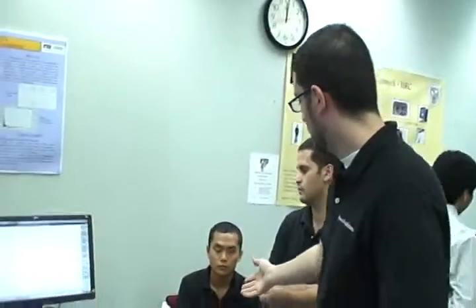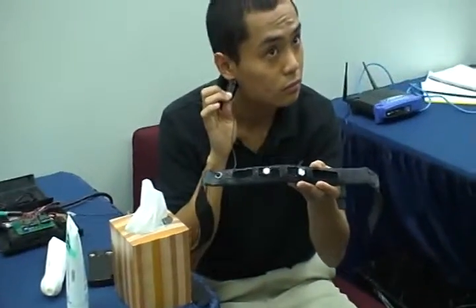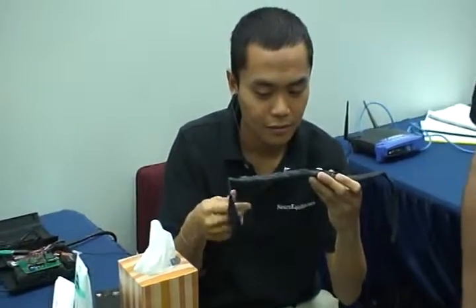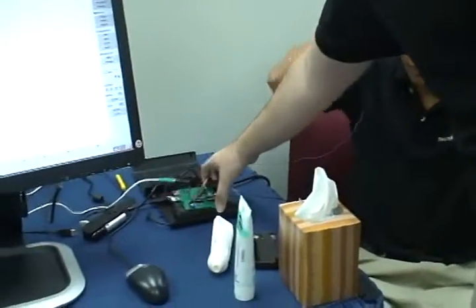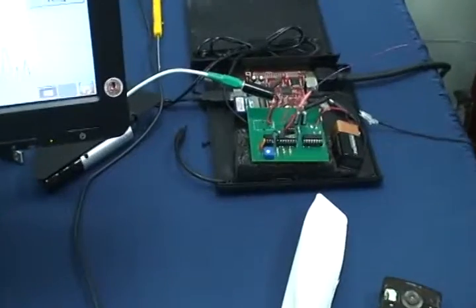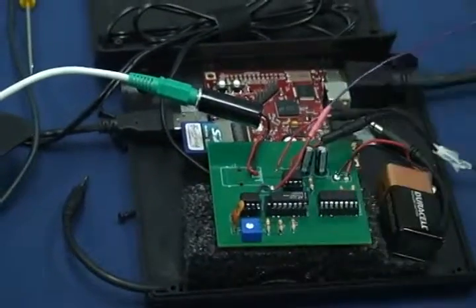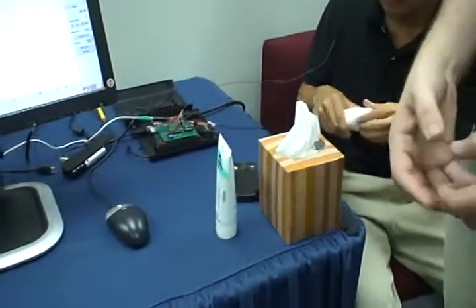So for our project, what we're doing is we have two nodes placed here, which Arnold will place on his forehead, and a reference node on the ear, which will read the signals from his brain in a very general state. This frequency is sent into this PCB we created, which is filtering and amplifying it. It's a very low signal, between 1 and 100 microvolts, so very, very low and very susceptible to noise.